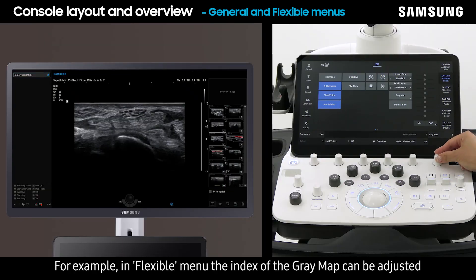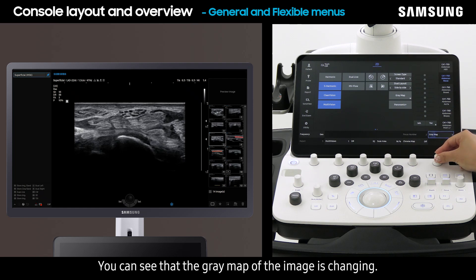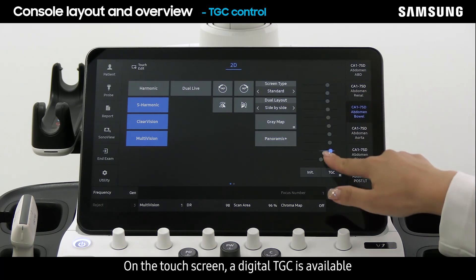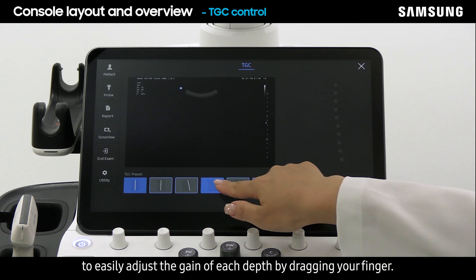For example, in the flexible menu, the index of the gray map can be adjusted by turning the corresponding knob. You can see the gray map of the image changing. On the touch screen, a digital TGC is available to easily adjust the gain of each depth by dragging your finger.